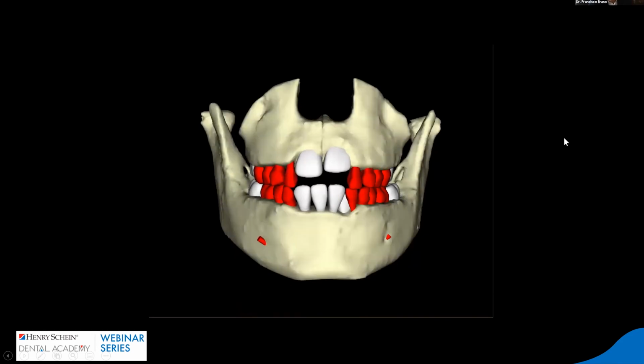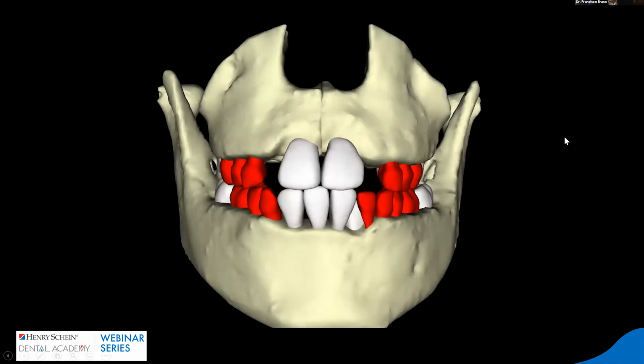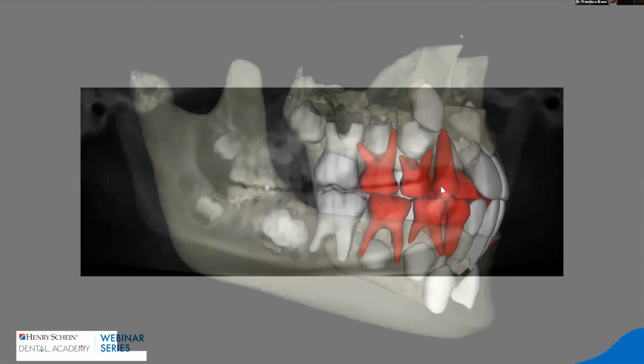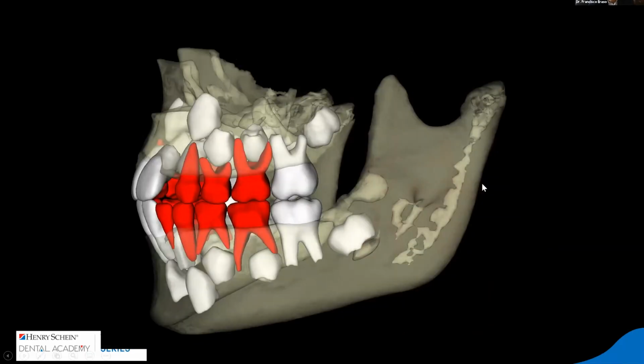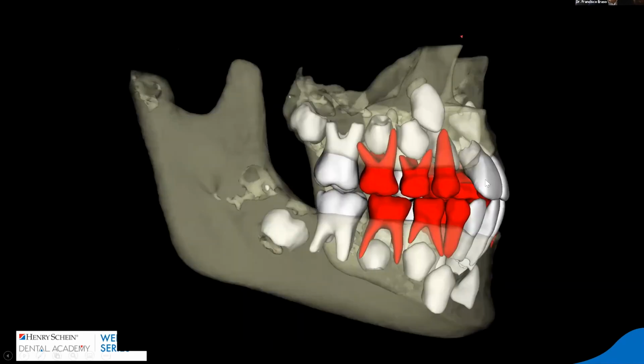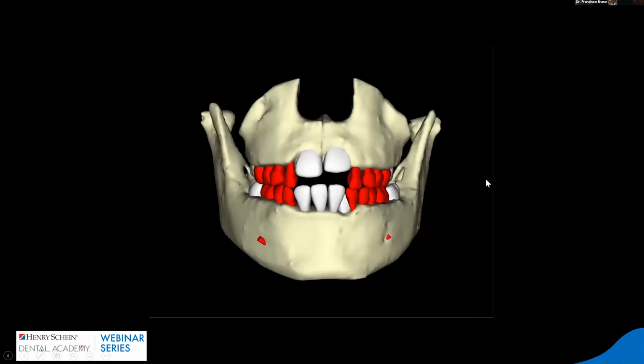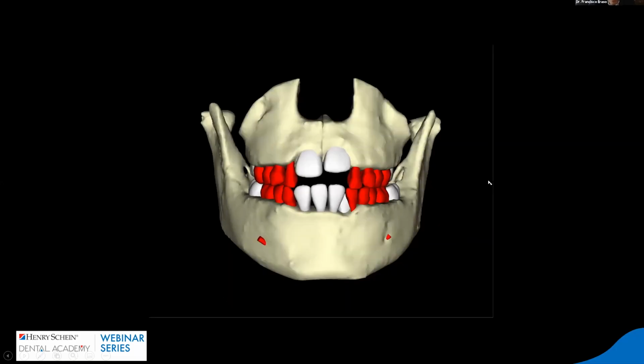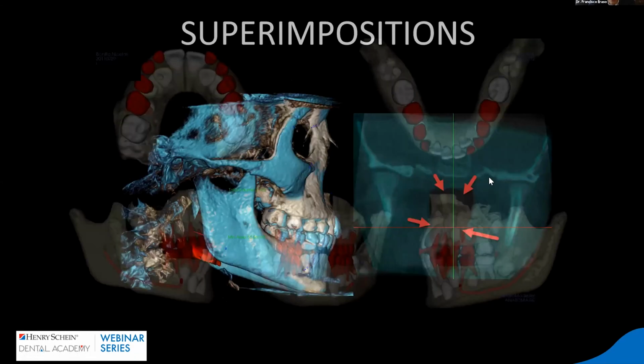And then you have that. This is the result after the extractions of the baby teeth, and then this is the follow-up X-ray. And then you have some renderings of the possibility of expansion, okay? So I think the renderings of the expansion are somewhere here.